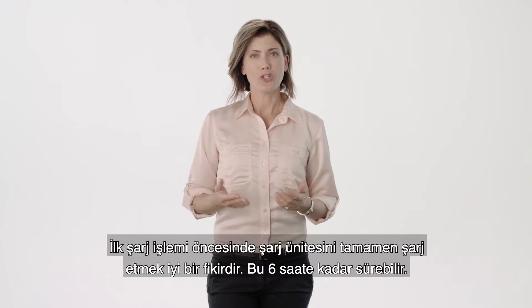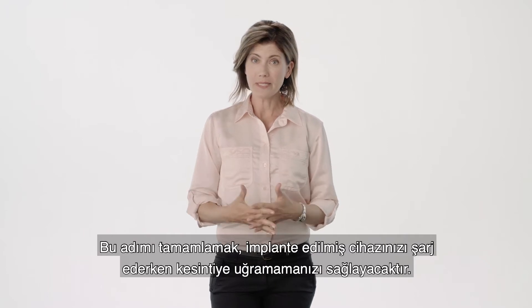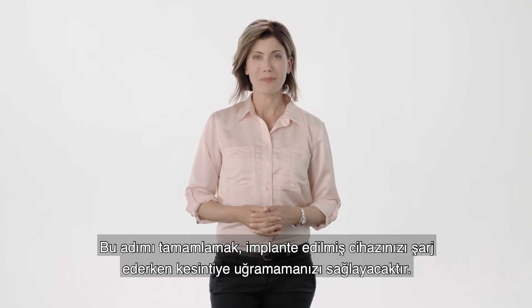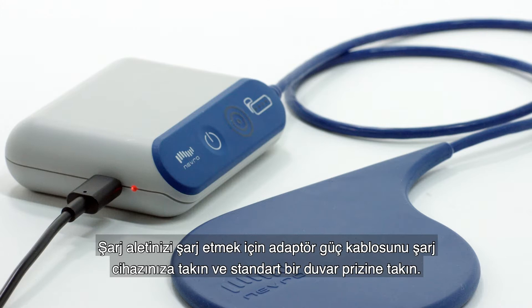Before your first charging session, it's a good idea to fully charge the charging unit. This could take up to six hours. Completing this step will ensure you will not be interrupted while charging your implanted device. To charge your charger, simply attach the adapter power cord into your charger and plug into a standard wall outlet.